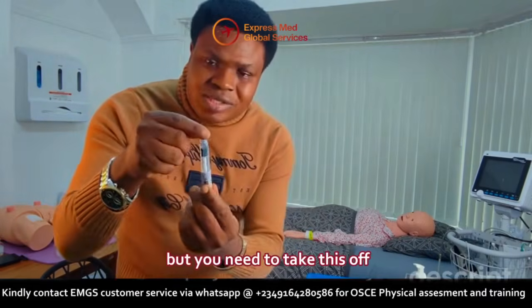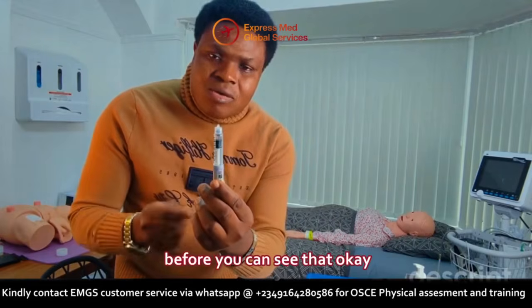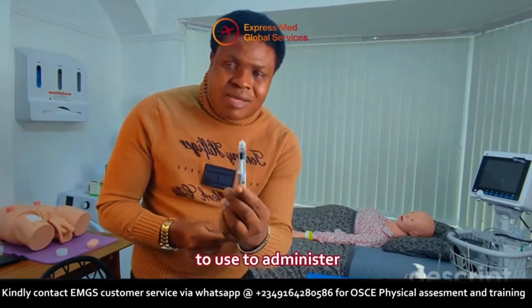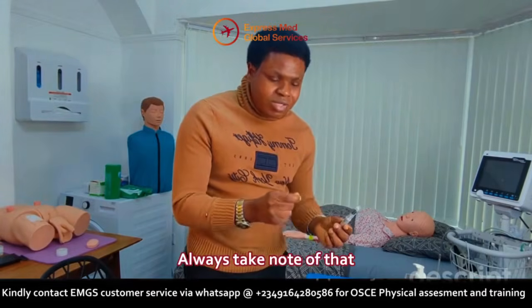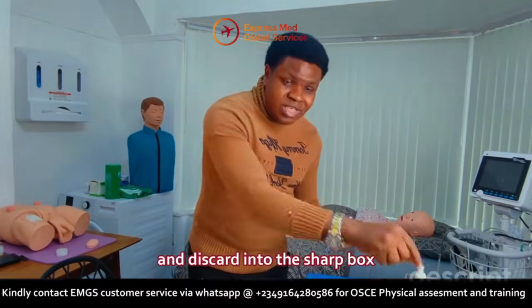But you need to take this off so you can see, okay, here comes the needle I'm going to use to administer. Remember, whenever you take off, you are not supposed to what? Recap. Always take note of that. So for this case now, we are going to discard into the sharp.